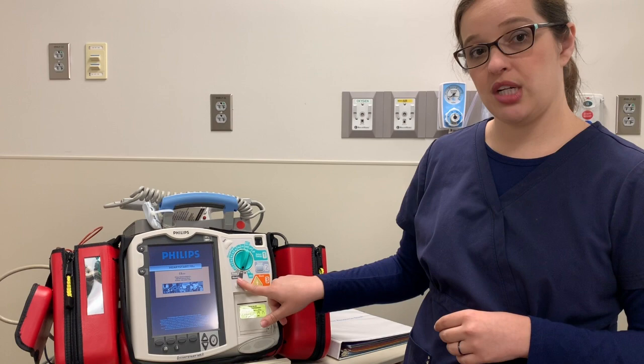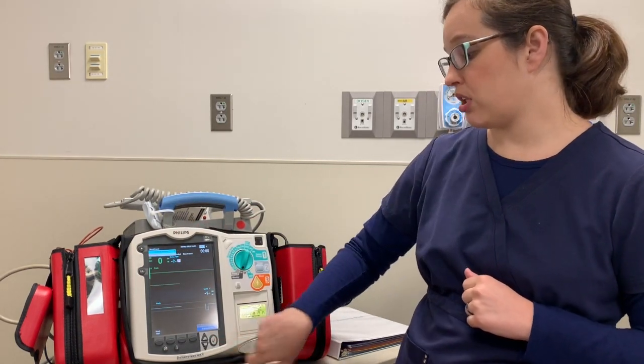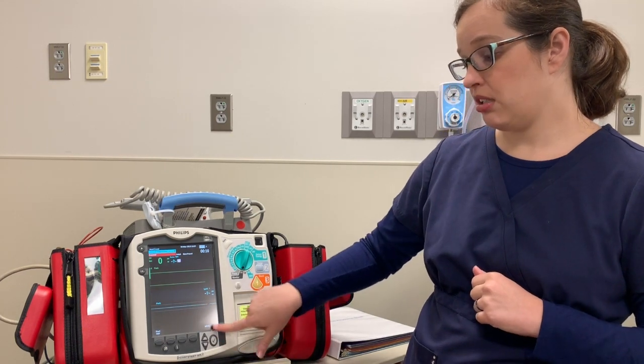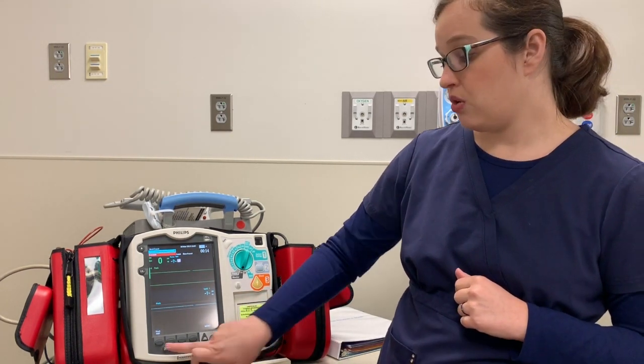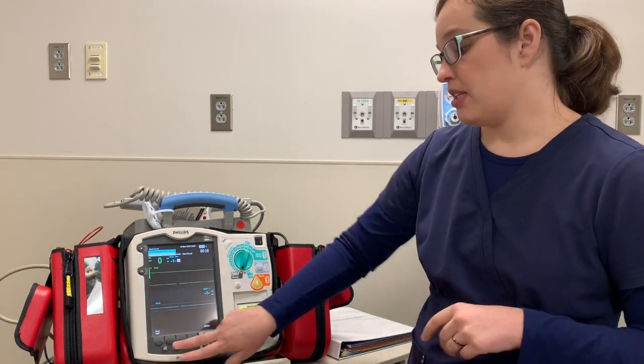You do have a monitor option that allows you to monitor a patient that you're transporting if you need to take the full defibrillator because you're concerned they may code in the hallway. There's a silence button — when the alarm's going off, you have the ability to silence from here, and you also have this button here that you can silence the machine with. This will silence it for a two-minute time frame.